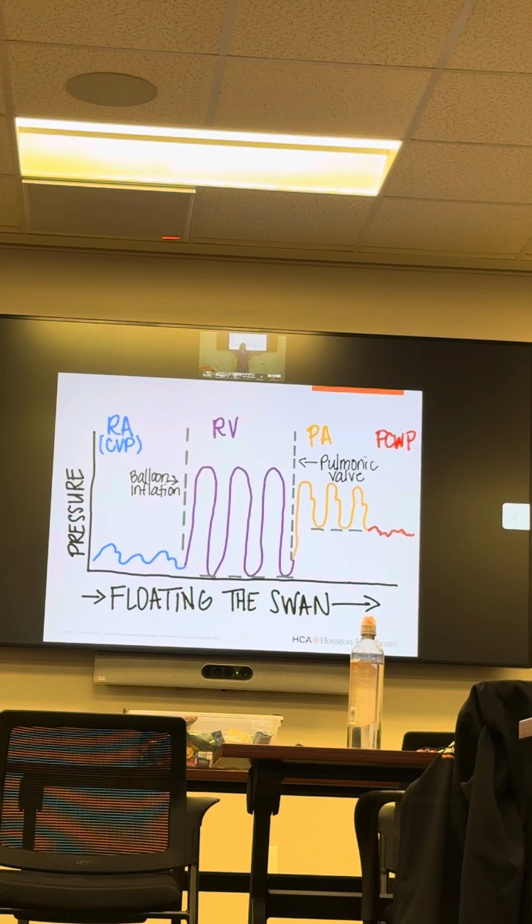If you are looking and you see a wedge pressure that is quite high, greater than that 15 area, and a normal CVP, that's not fluid overload, is it? That's that left side is not ejecting. But switch it. If my right side, that low pressure system, is higher than that muscular high pressure system, that's not fluid overload either. That's my right side isn't working. My right ventricle isn't sending it to the left.